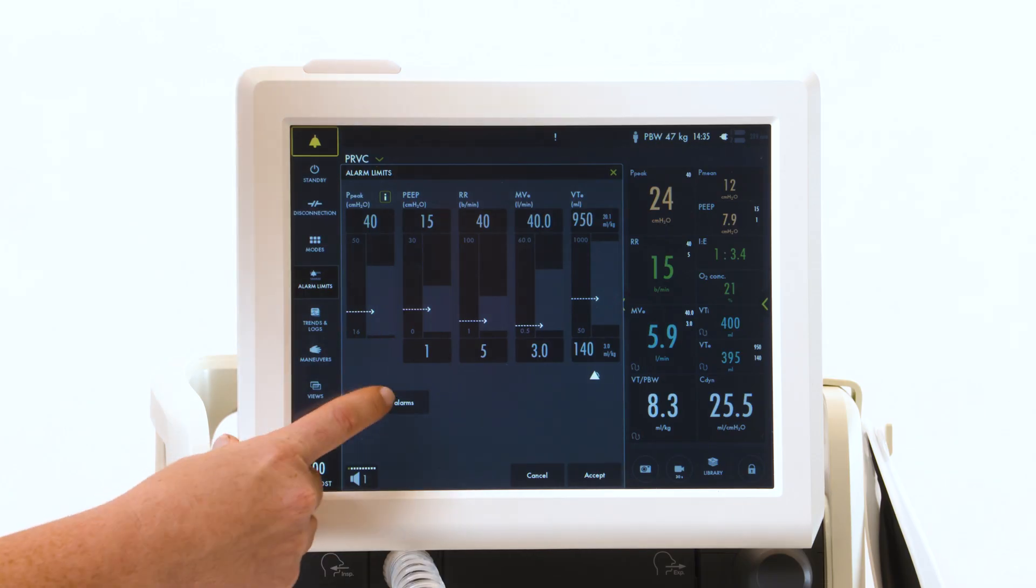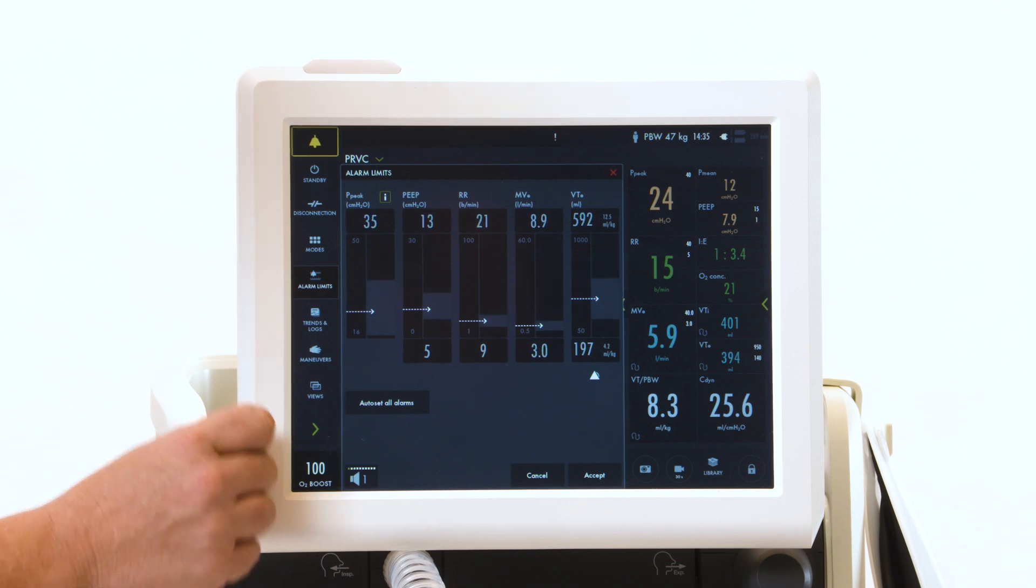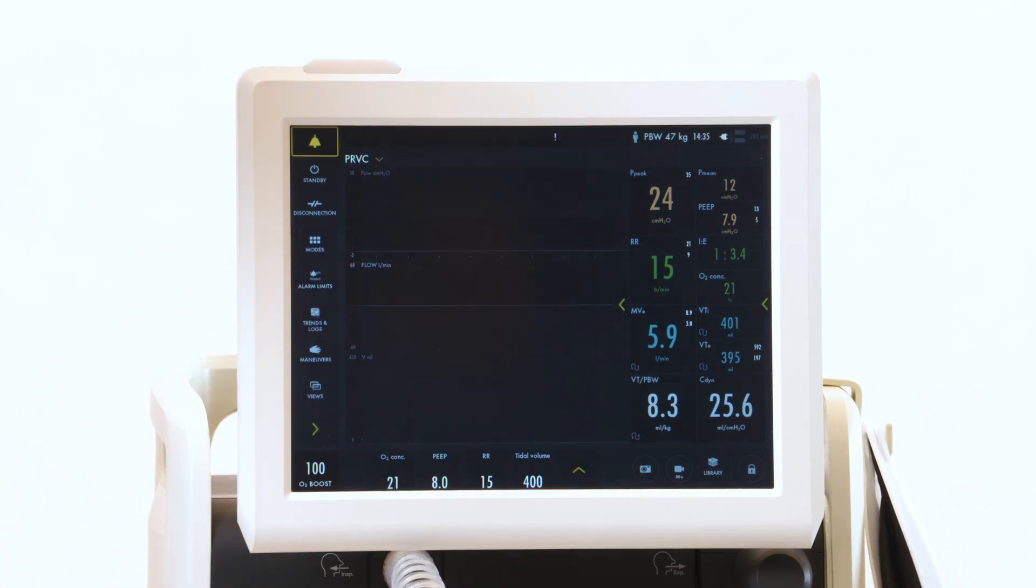There is also an auto set feature available in control modes of ventilation for the alarms. They will set the upper and lower alarm limits based on what your patient is currently doing. It is located here and the ventilator will make the adjustment. If you're happy, you then hit accept.